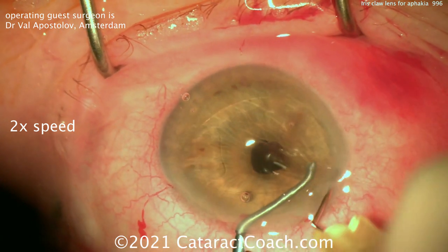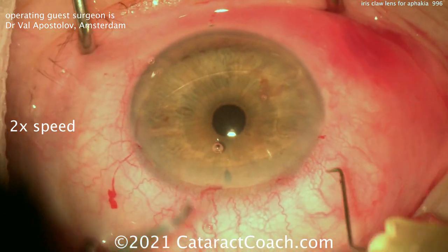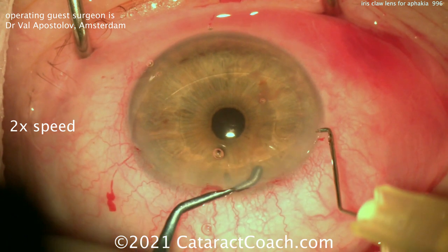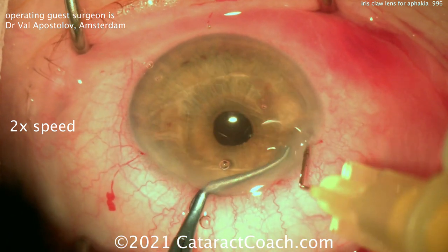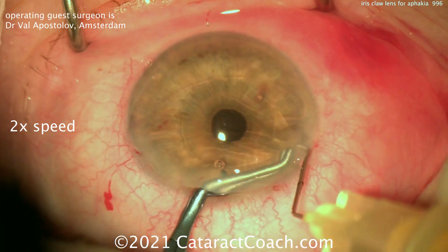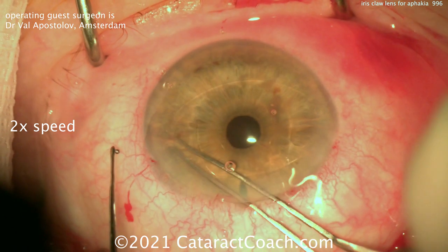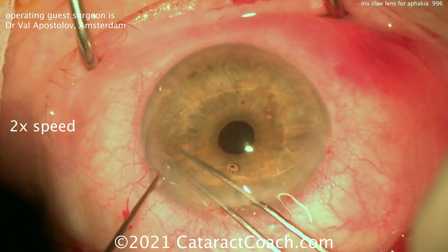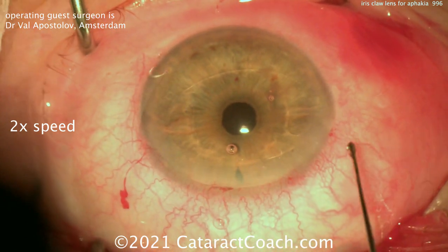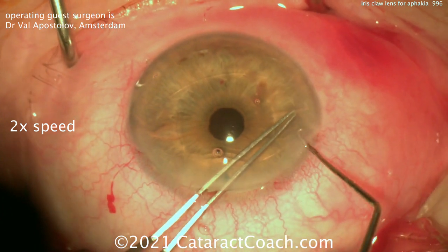You want to make sure that you capture enough of the iris to have very strong fixation. The question we sometimes get is: what about putting the same lens on the posterior surface of the iris? That can be done as well, but according to Dr. Apostolov, that may not provide enough support. Notice also, subincisionally, there's a small peripheral iridotomy that's been performed, and really making sure that there's a good grab of tissue in the claw of this lens.